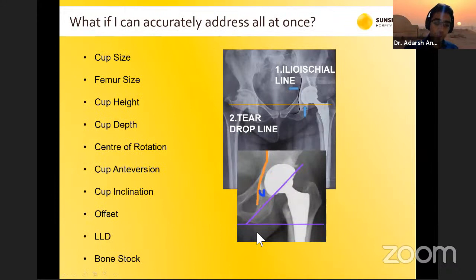So there are so many variables in a hip replacement. Yes, it is a very good surgery. The forgotten joint scores are very, very high, and the patients usually have very good outcomes. But there are so many variables which actually come into play. There's the cup size, the femur size, the cup height, the depth, the center of rotation, the anteversion and the inclination, and of course the offset, the limb length discrepancy, and the bone stock as well.